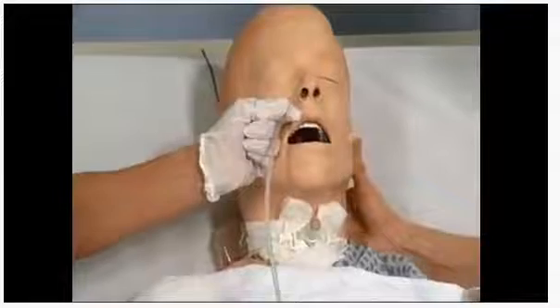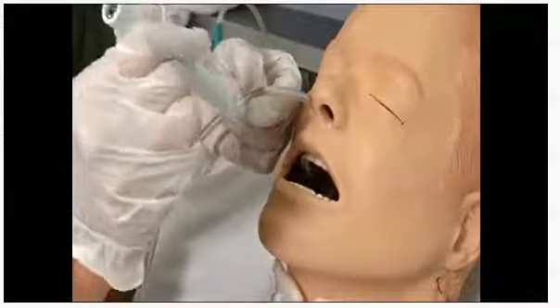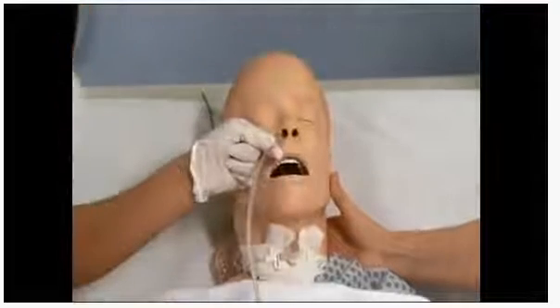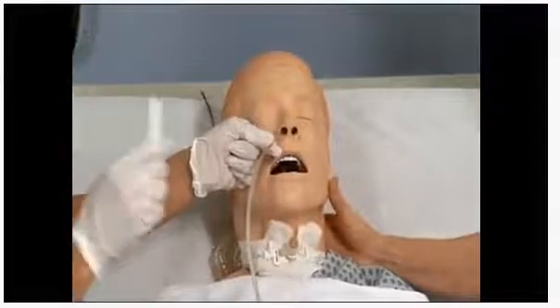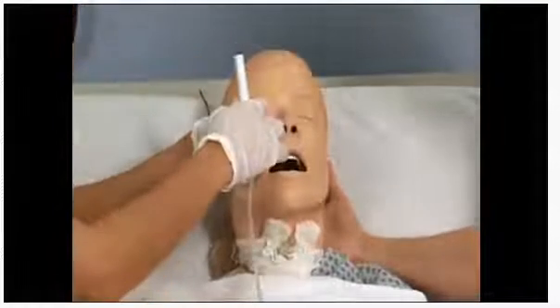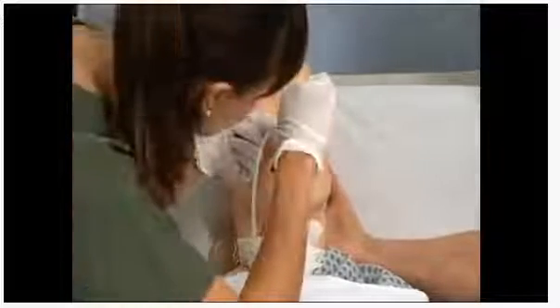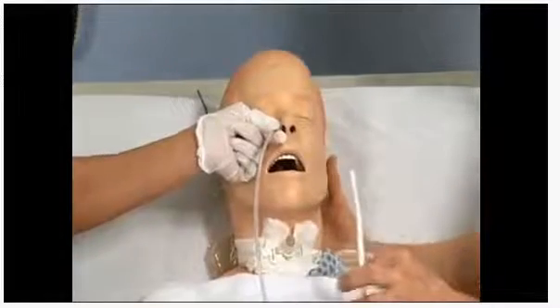At this time, I want to go ahead and get my pen light and take a look in the mouth, and I can see it in the back of the throat because you want to make sure that it doesn't begin to coil in the mouth. And if you needed to use your tongue blade, you can. You can have your assistant hold on to the tube, but with the patient having their mouth open, I can see just fine. Okay.